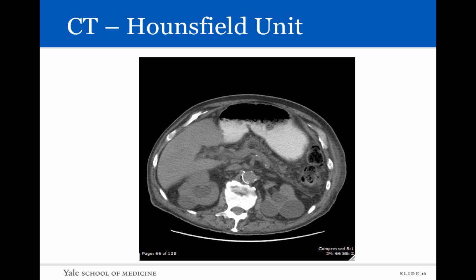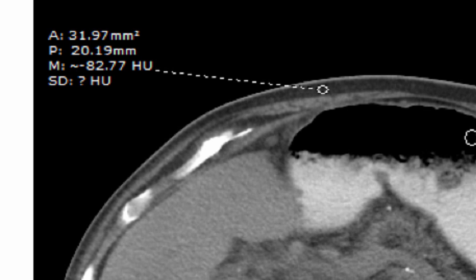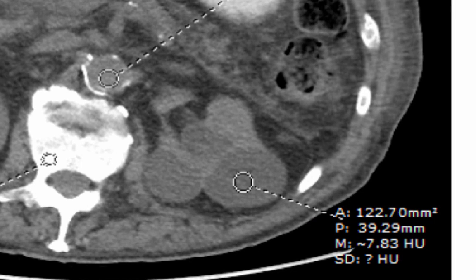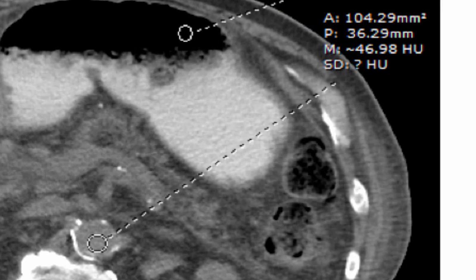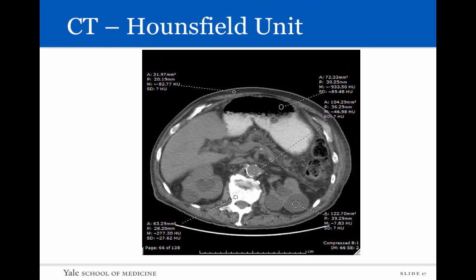Let's see how we can use this practically. Here we have a CT scan with the patient on their back, with right and left sides identified. This is a non-contrast study, as the aorta is a shade of gray. We have given oral contrast, which is why the stomach contains bright material. On CT imaging, we can measure Hounsfield units by drawing circles around different objects. For example, subcutaneous fat has a Hounsfield unit of approximately minus 83 — consistent with fat. Air in the stomach, which looks black, has a Hounsfield unit of minus 934. A simple cyst has a Hounsfield unit of 8, consistent with water. Blood has a Hounsfield unit closer to 50, and bone has a Hounsfield unit of 277. This is how we use Hounsfield units to recognize the contents of any structure.